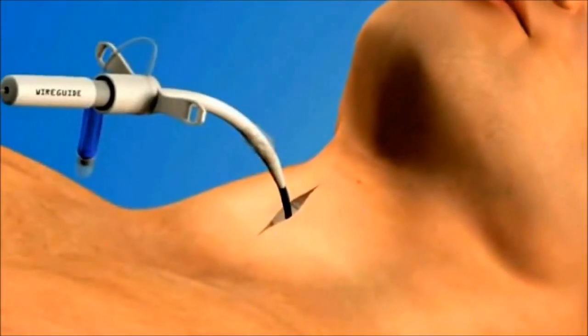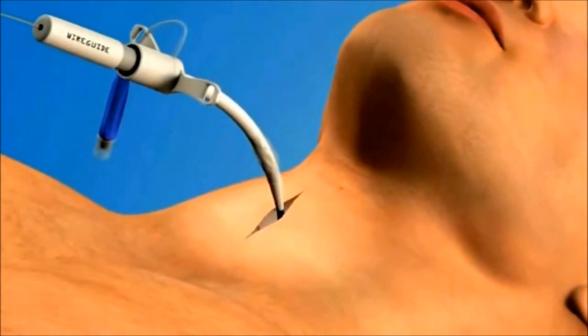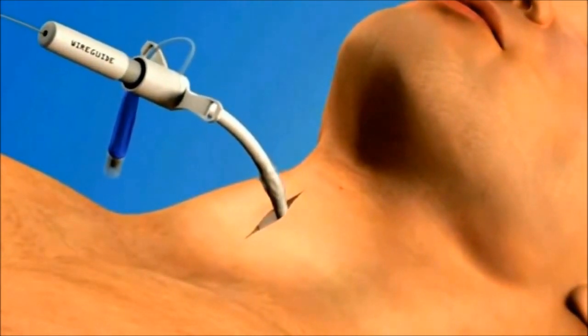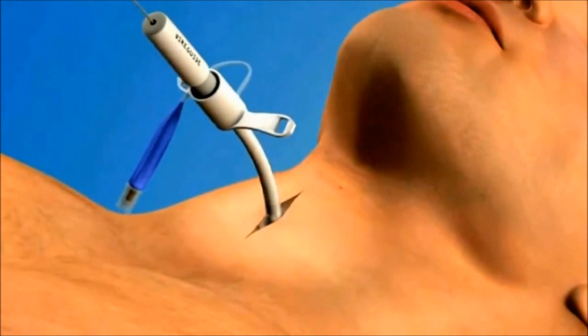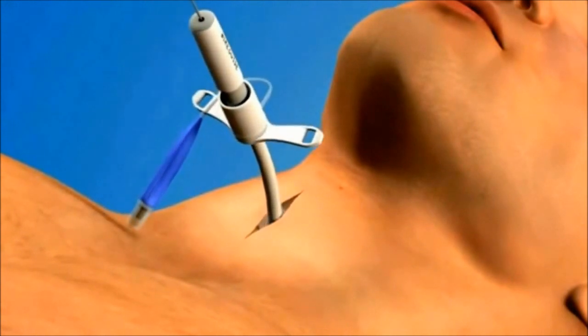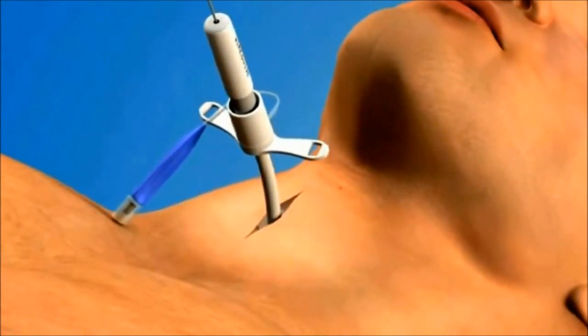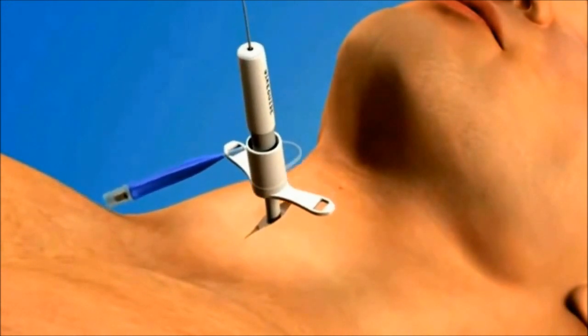Advance the dilator and the airway catheter as a unit into the trachea using a reciprocating motion. The hub and flange of the catheter should be flush against the skin.